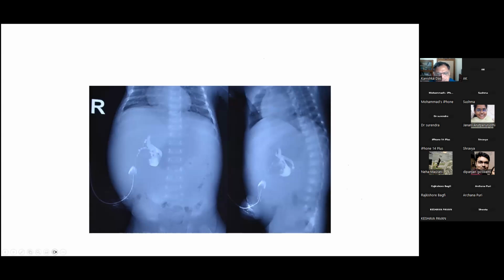Yes, this is an interesting one. Who's taking this? Some volunteers. A newborn, 20 days old, presented with distended abdomen. So it looks like a spontaneous ascites, perforation. Spontaneous biliary perforation. Percutaneous cholangiogram showing spontaneous biliary perforation.